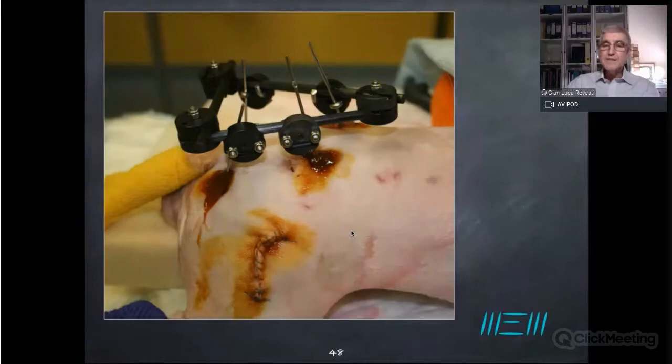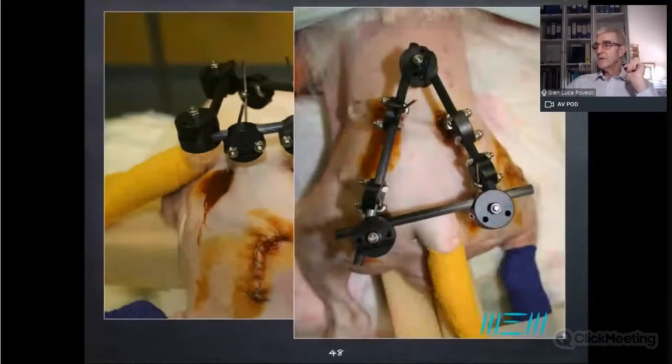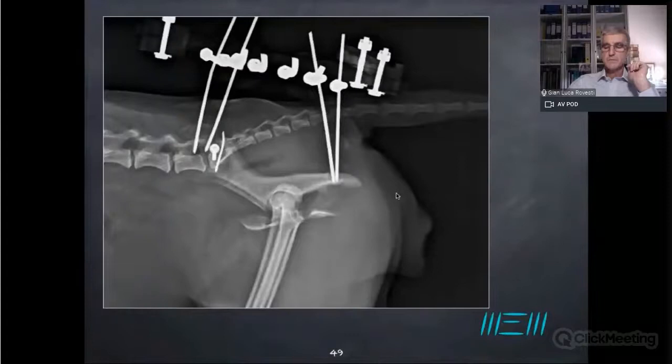Okay, look at this. A minimum of room between this bar and the tail root. Why? Because the dog should be able to elevate the tail during defecation. And this is the post-op lateral view. This dog will be allowed to full weight bear, of course restricted, but full weight bear immediately after the surgery.